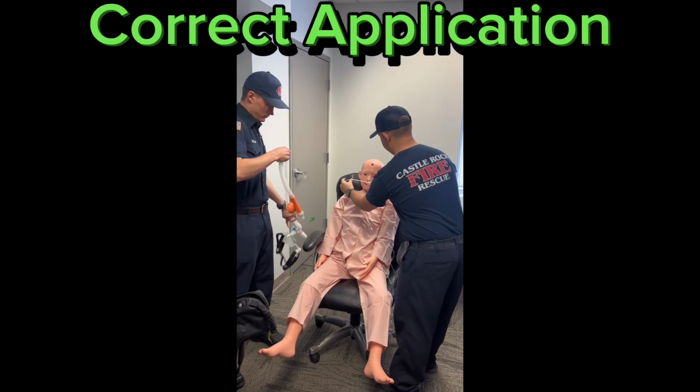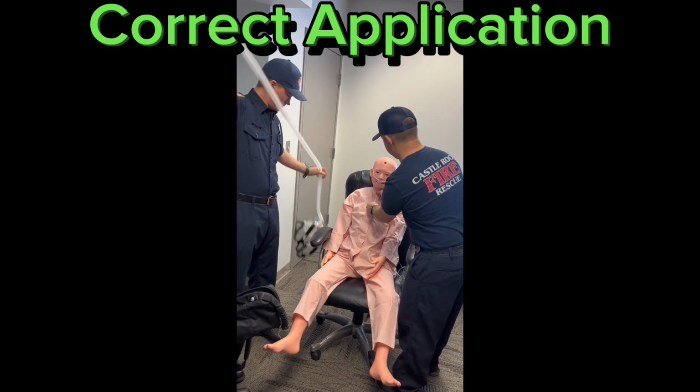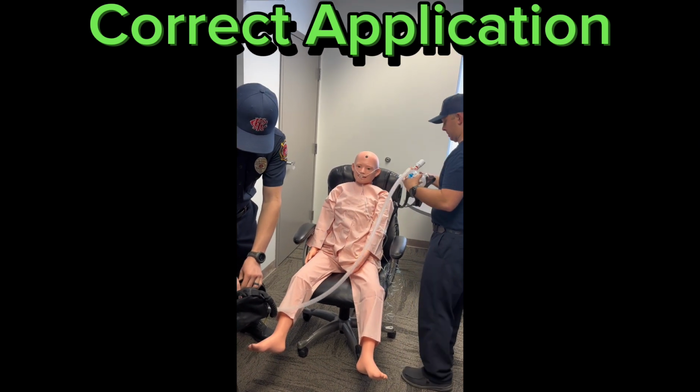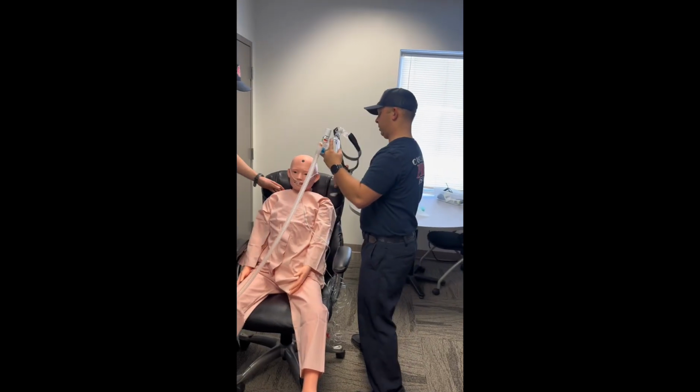Now we're going to watch correct application. So we're going to start out with the capno cannula. Colin's going to fully extend the accordion tubing. EJ is going to unclip that white clip. And then this is a two-person job.